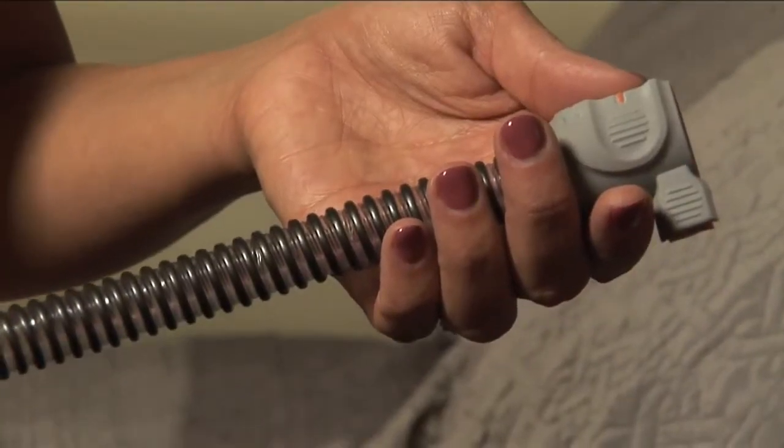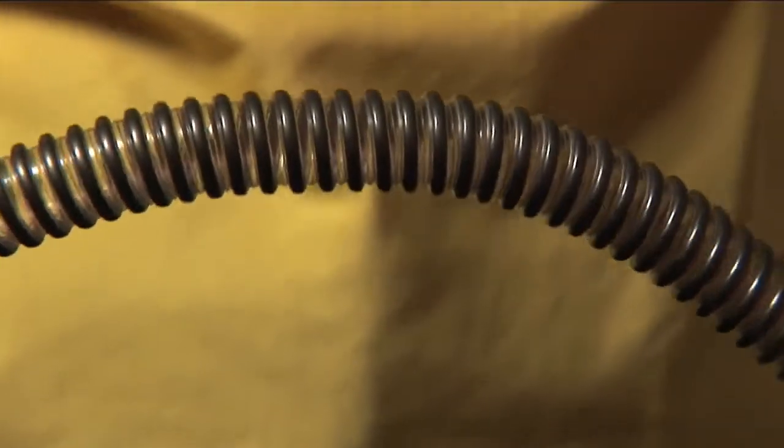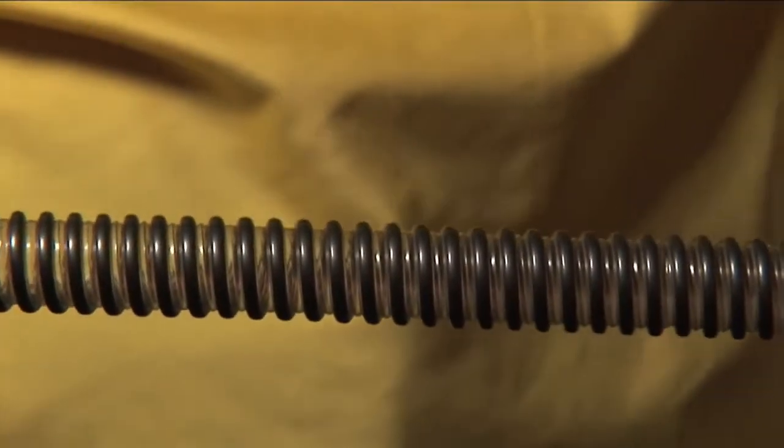Even though they are made of strong material, you still need to avoid crimping the hoses. Don't allow the hose to get trapped between two objects that might pinch the hose, such as the mattress and headboard or the drawer of a nightstand.